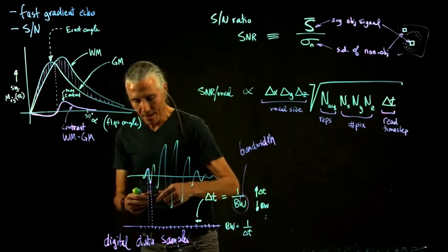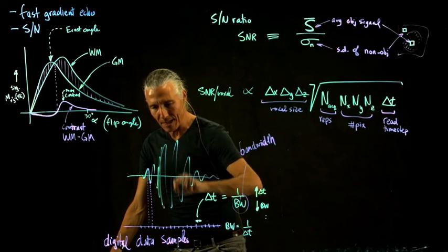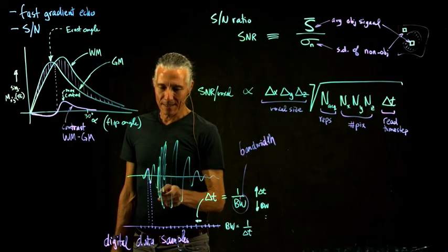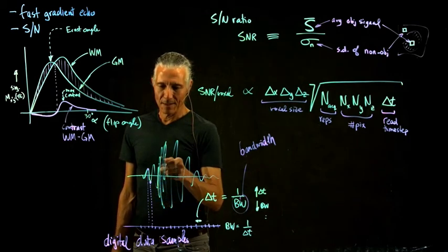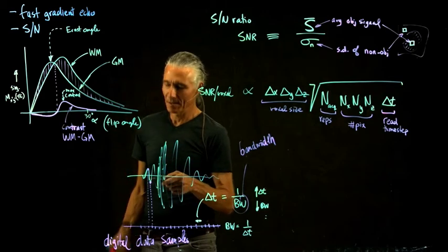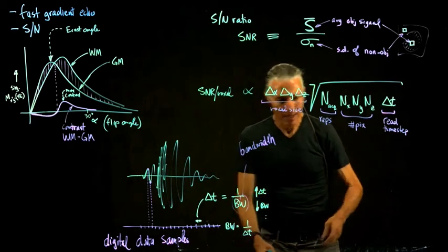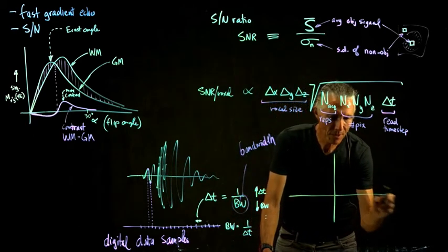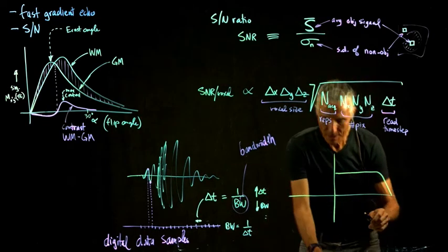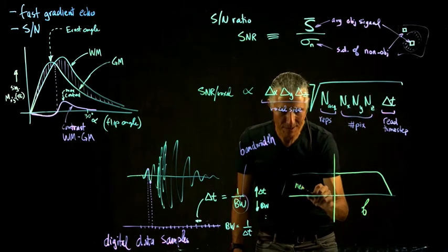If we had a really high frequency signal in here, going up and down very rapidly like that, and we sampled it, we might just nail different parts of this oscillation and get a fake signal that's actually not the real signal. So the rule when you're sampling is you have to essentially roll off. This is frequency here, and there's also negative frequency. We'll get to that later.